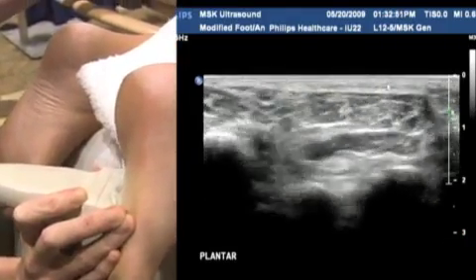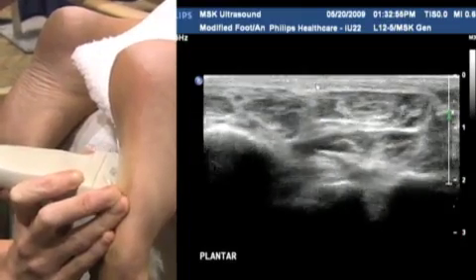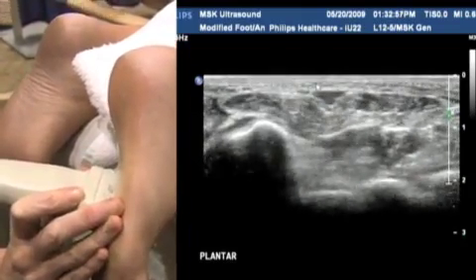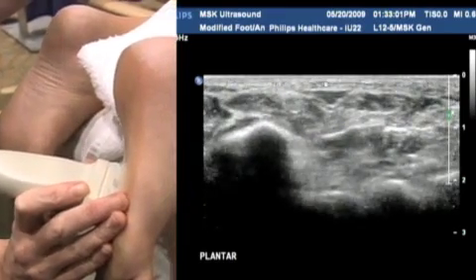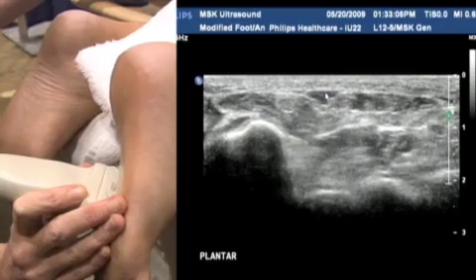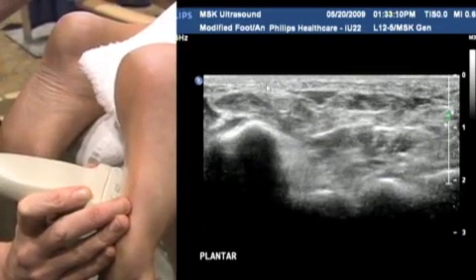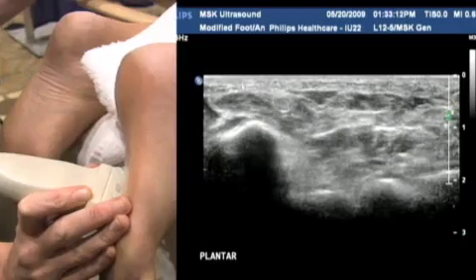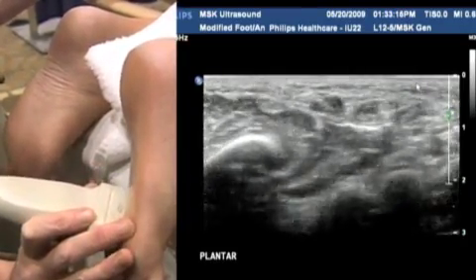until we get all the way down towards the toes, and you can see how spread out it becomes. So it's really important to make sure as you assess, particularly in this transverse section, that your eye scans all the way medially to all the way laterally and doesn't just stay focused on that central portion of the plantar fascia, because you can have quite extensive and distal fibromas sitting right out either side. So it's really important to be aware of that.